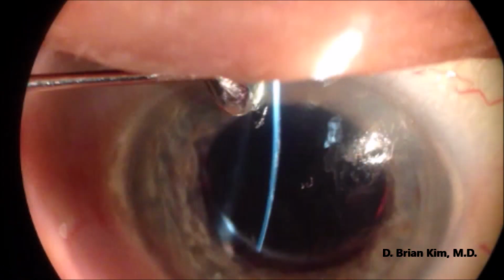So this is the technique I developed called the corneal sweep test, which detects occult corneal erosions. I encourage you all to try this technique because, again, there's a lot of patients suffering with this problem. It's an easy way to diagnose this problem directly and precisely, and you'll be able to cure these patients after performing a superficial keratectomy.